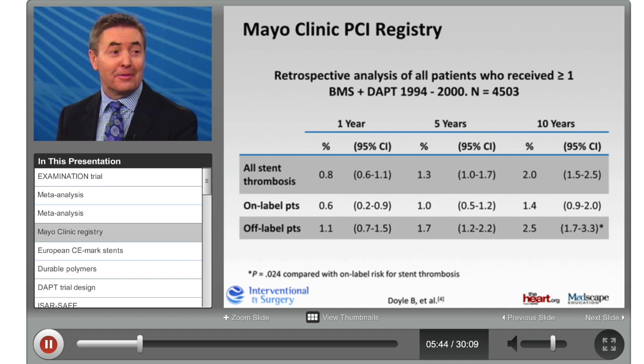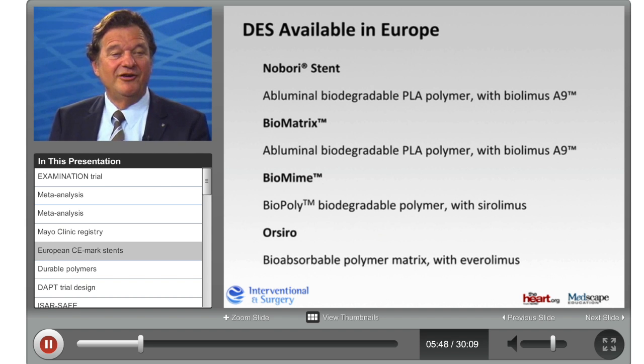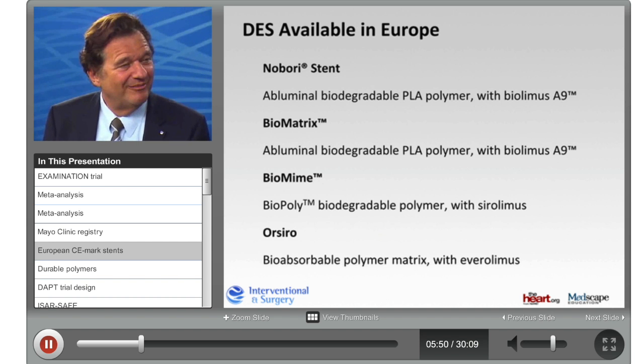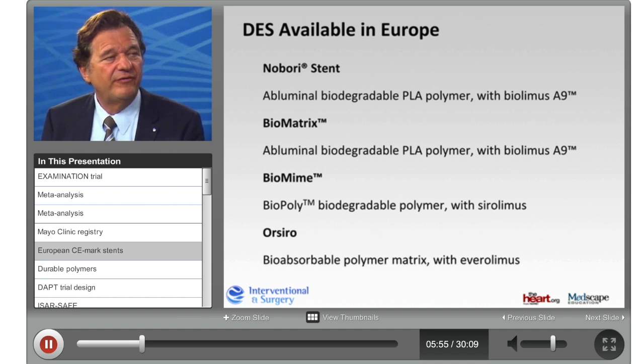In Australia, they're a part of clinical trials. It's my pleasure that I'm the only one here actually using the devices which we're talking about. Right. So of course we have practical experience. In Germany, we have 4 different drug-eluting stents with bioabsorbable polymer approved.